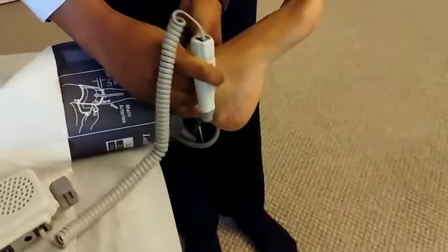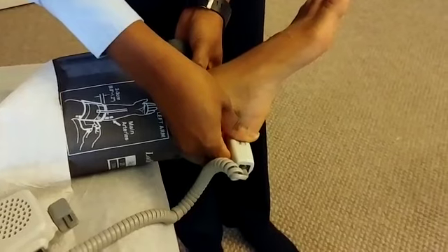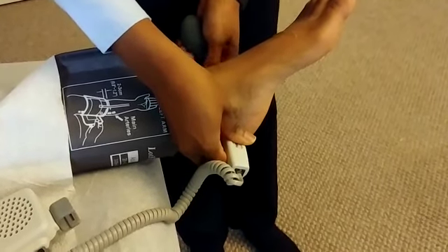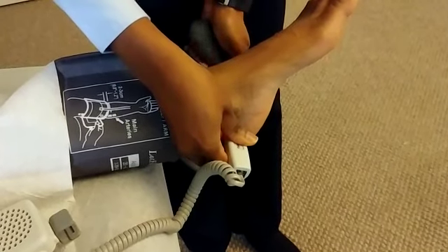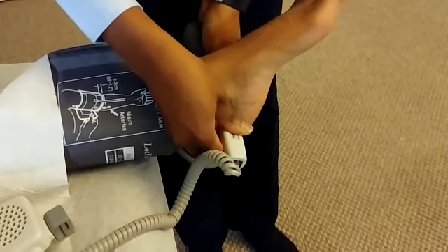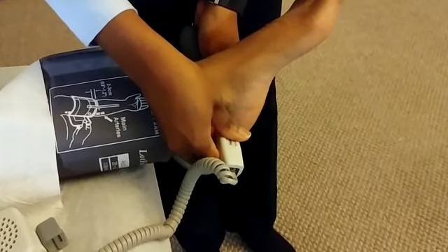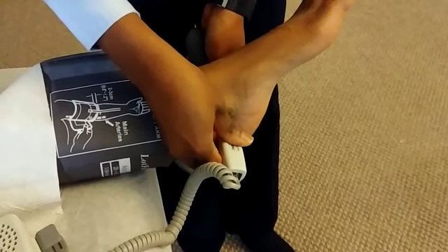You want to look at that bone right there, and you want to follow that artery, trying to look for it right around the bone. You can hear it again. I'm going to inflate. Again, it stopped at about 170. I'm going to slowly increase it to about 200 and slowly start to deflate. And that's it at about 150.